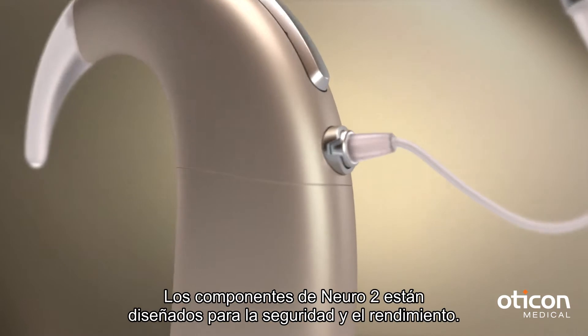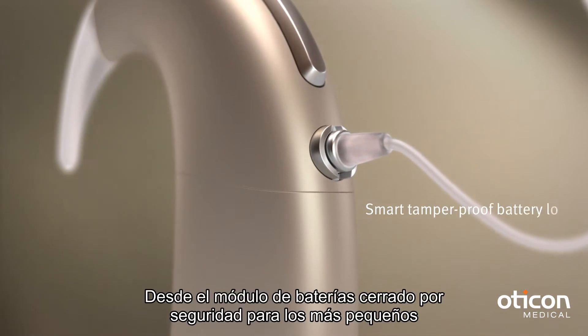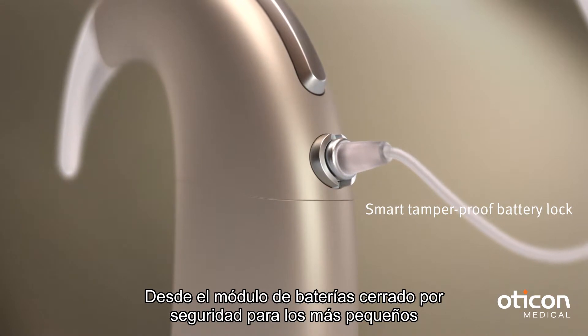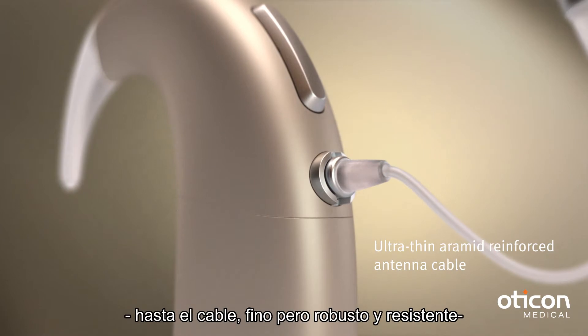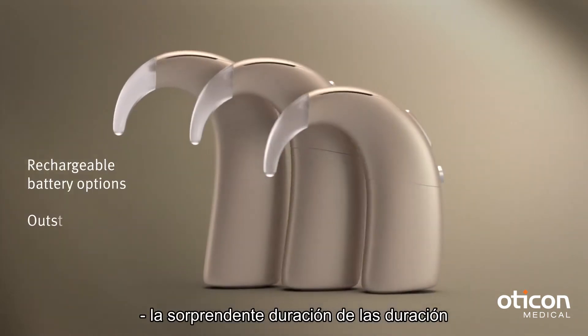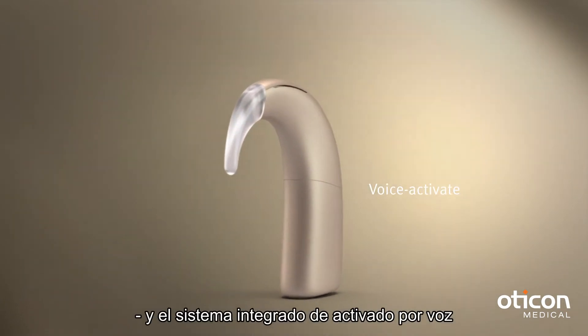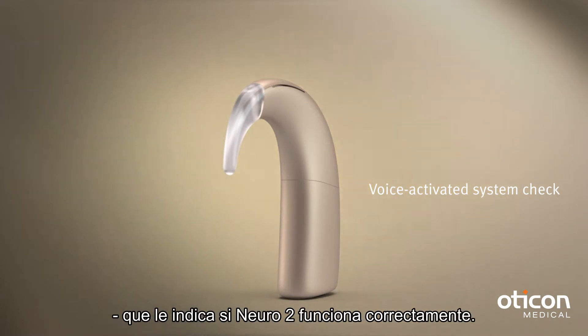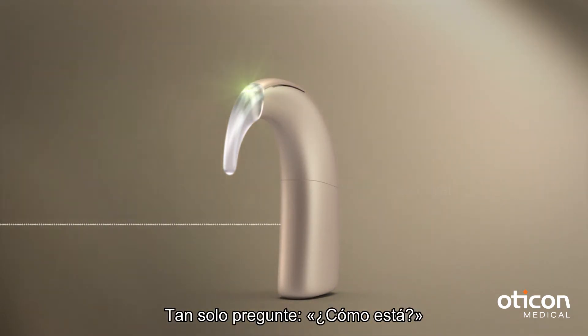All components in the Neuro 2 are designed for safety and performance — from the lockable battery door that keeps out little fingers, to the thin yet very strong cable, the outstanding battery life, and the voice activated system check that lets you see if your Neuro 2 is working correctly. Just ask: how are you?